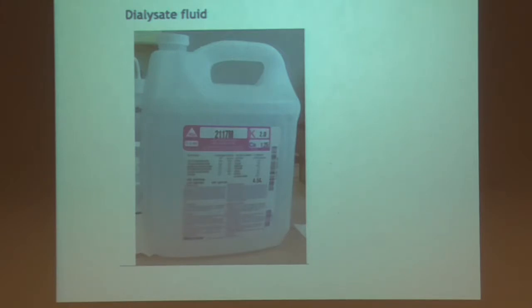What's interesting here is the bicarbonate buffer is actually sodium bicarbonate. Years ago they had tried lactate as the buffer. Patients didn't do that much better, in fact a little bit worse with the lactate arm, so they go with sodium bicarb. My wife's in critical care, so we used to argue about whether bicarb is safe or not. Yes, there's a risk sometimes with severe respiratory acidosis, but a lot of times with AKIs and acidemia, whether you give bicarb in their IV or through their dialysis, it's the same sodium bicarbonate. Whenever I tell our attendings that, they're always like, what?